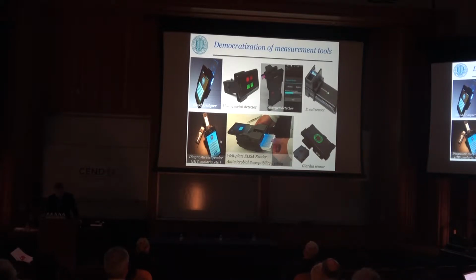This is also my conflicts of interest disclosure: I have 2 startup companies commercializing some of these technologies, and some of this work has resulted in products being used, such as this one, for example, which is a fluorescent, chemiluminescent, and colorimetric diagnostic test reader for various different lateral flow tests or vertical flow tests.